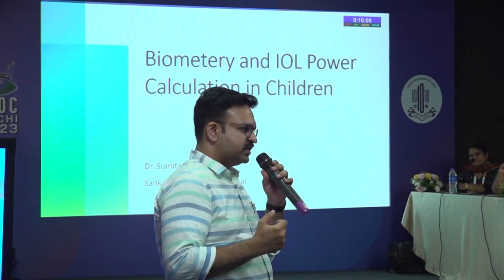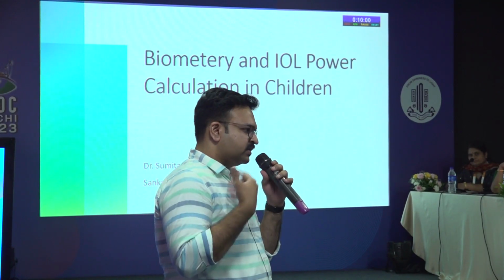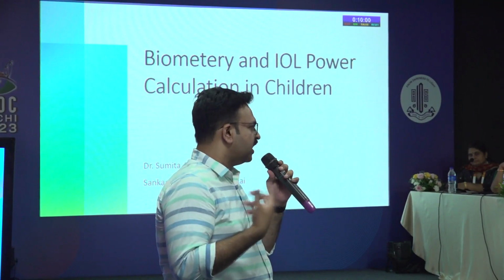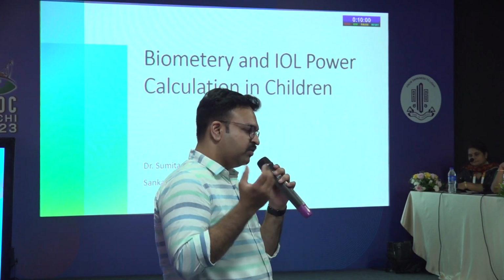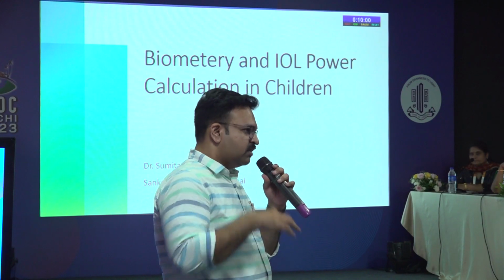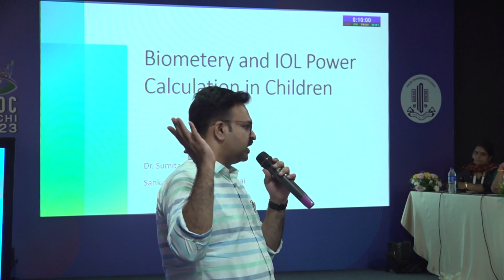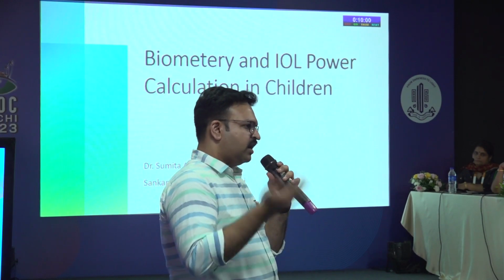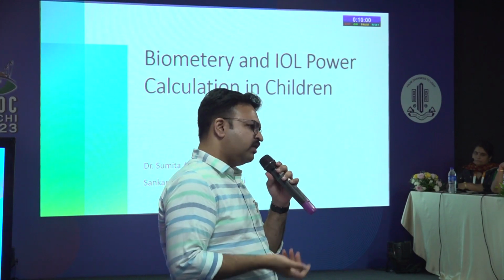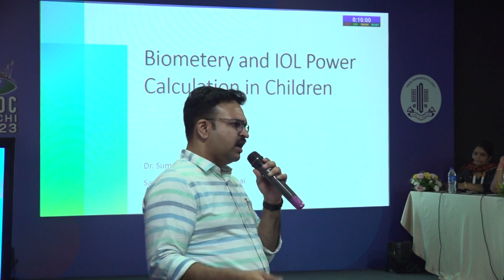One of the problems with hand ventilation is that the ETCO2 sampling won't be adequate. So most of the time what happens with hand ventilation is that you will be inadequately ventilating the baby. But with an inadequate sampling of ETCO2, the ETCO2 may be shown as normal, but the actual ETCO2 will be higher. So I always put them on the ventilator. Our ventilator has all the facilities like supporting spontaneous ventilation, paralyzing the baby, everything we can do.